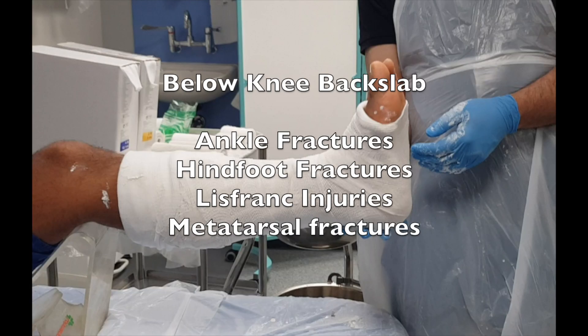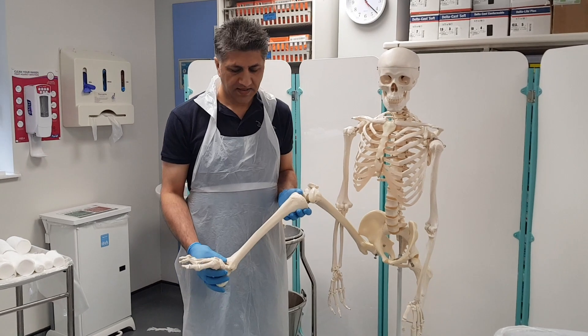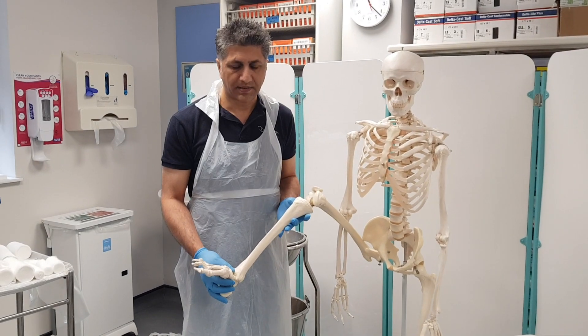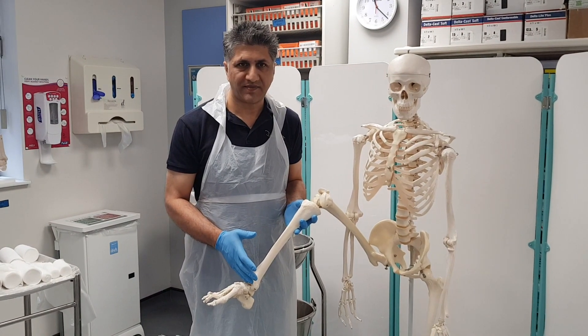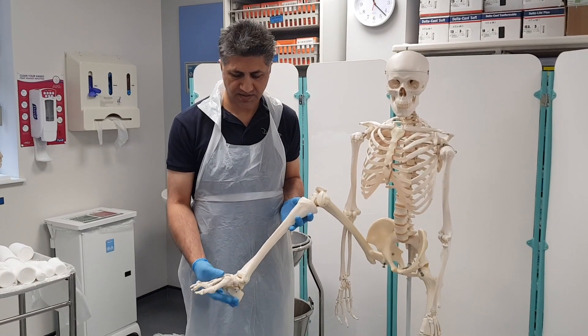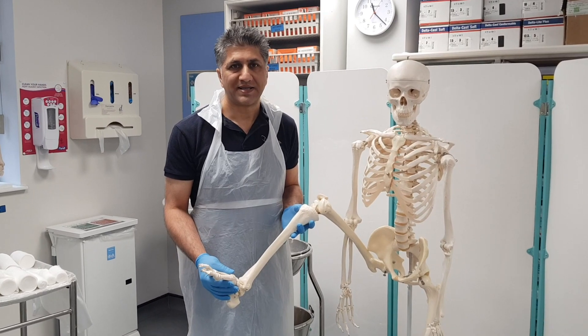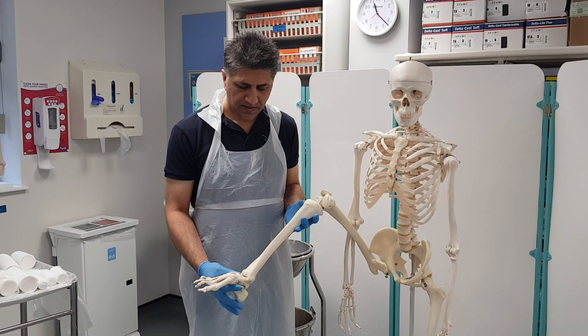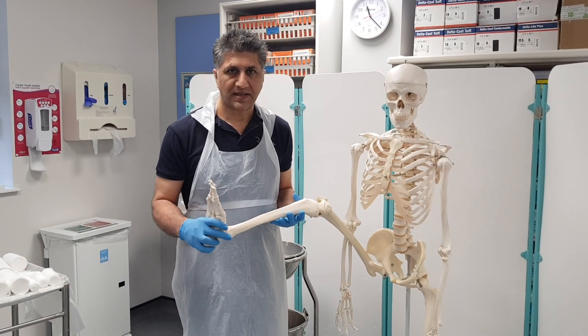In this video we're going to demonstrate how to apply a below-knee back slab. With a below-knee back slab you can control distal tibial and fibular fractures, which are ankle fractures, you can control metatarsal fractures, and you can control Lisfranc injuries.